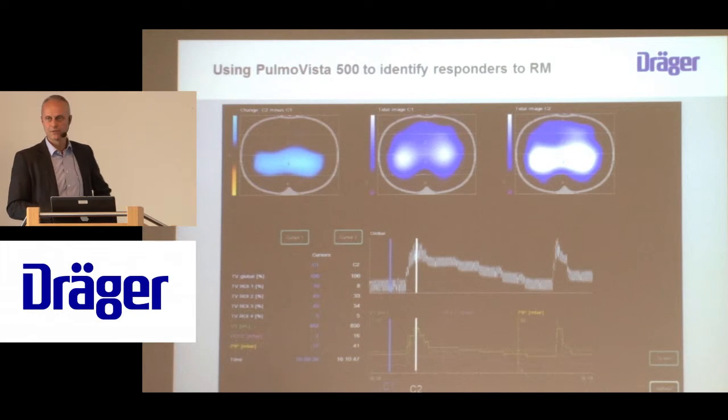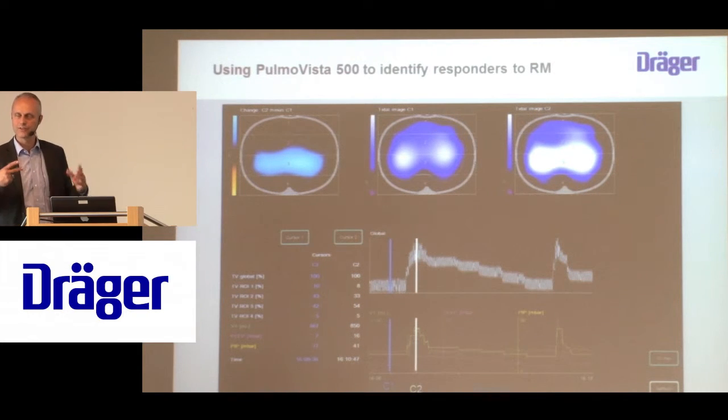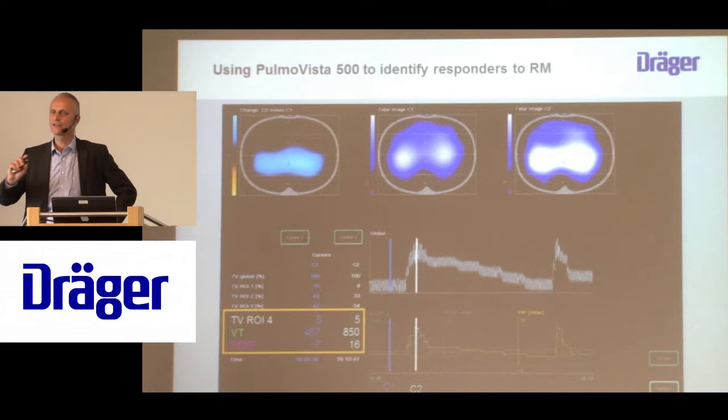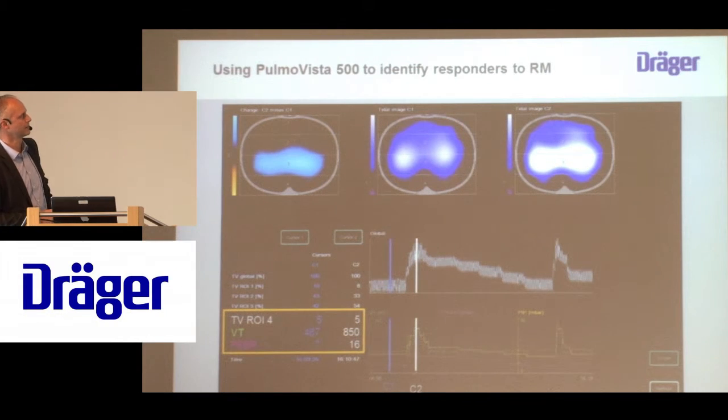Just to give you an example of how differently data can look from the same patient population with the same increase of PEEP, look at this. Here we have also just a very small dorsal ventilation of 5% at the baseline. But when you increase the PEEP from 7 to 16, it remained 5%. So nothing really changed in that patient.